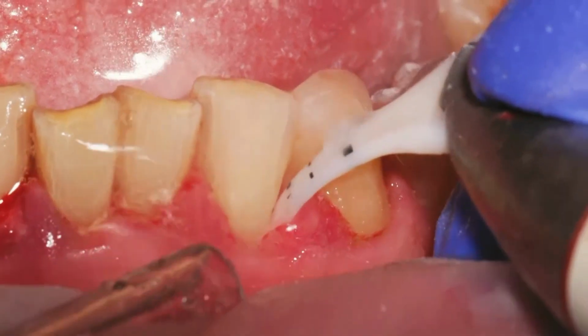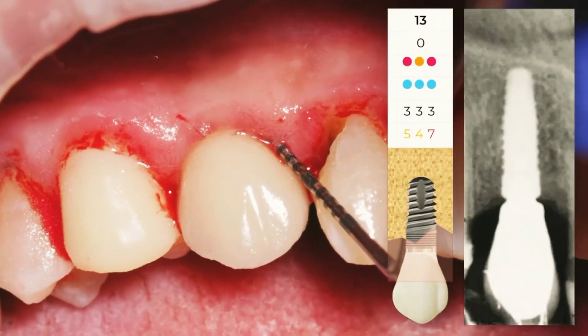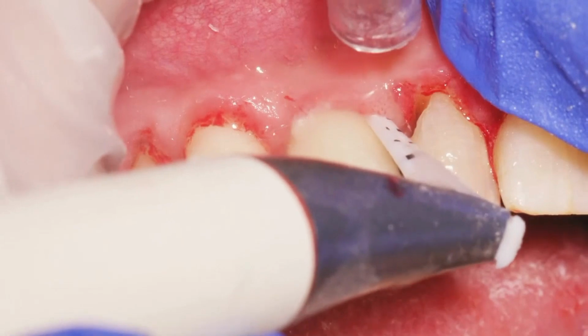What I suggest is to press with your finger the mucogingival line to avoid the risk of emphysema. But in these cases where we have very good soft tissues, not in terms of inflammation, but in terms of thickness, there is no problem, no risk.